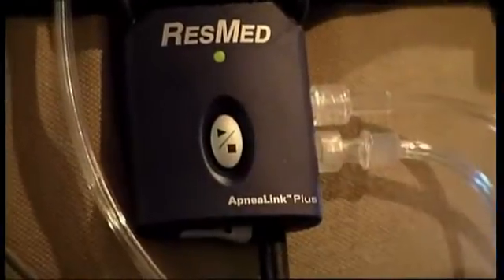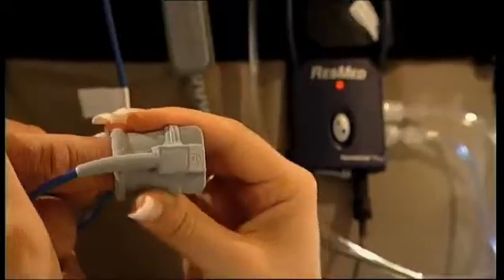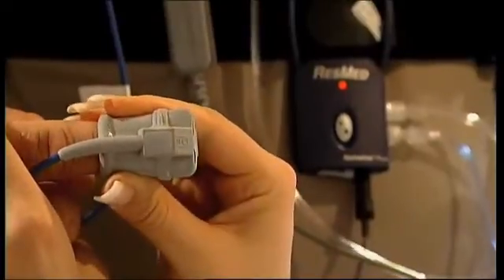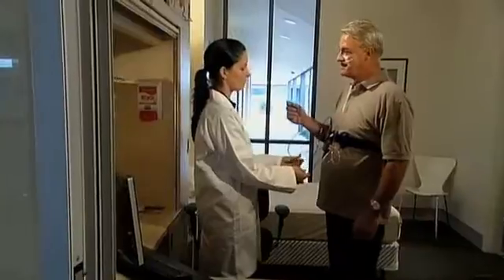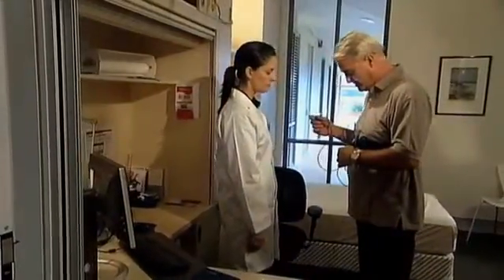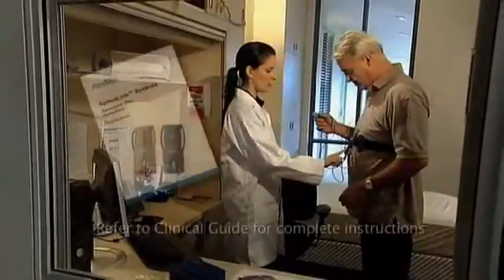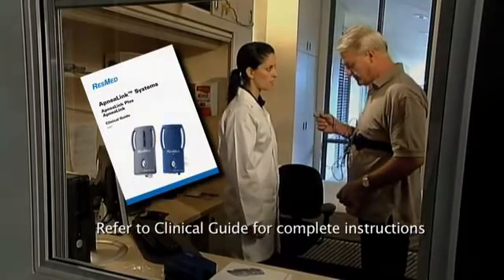Switching the recorder on is simple — press and hold the on button until the green light illuminates. If the light shows red, check that the pulse oximeter and finger pulse sensor are properly connected; once corrected, the light will turn to green after a few seconds. If the light stays off altogether, the batteries may need to be replaced or recharged. When operating correctly, the green light will dim after 10 minutes or so.